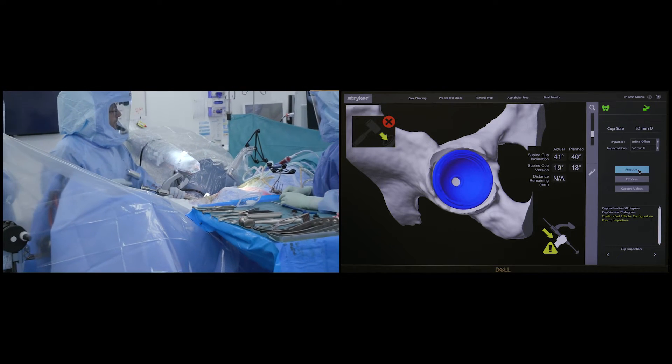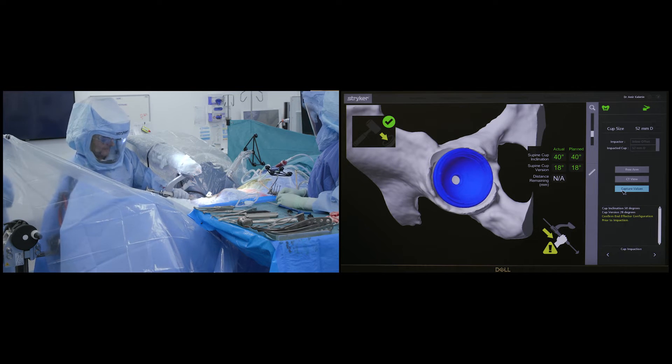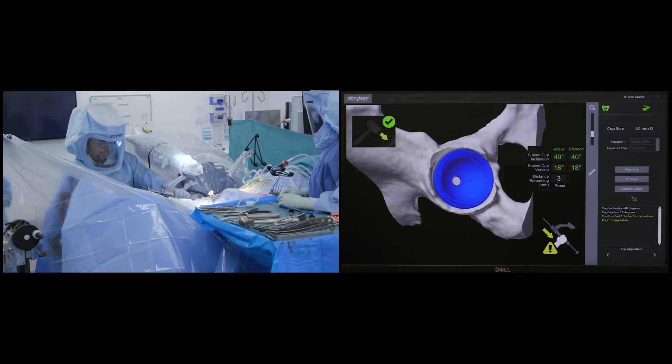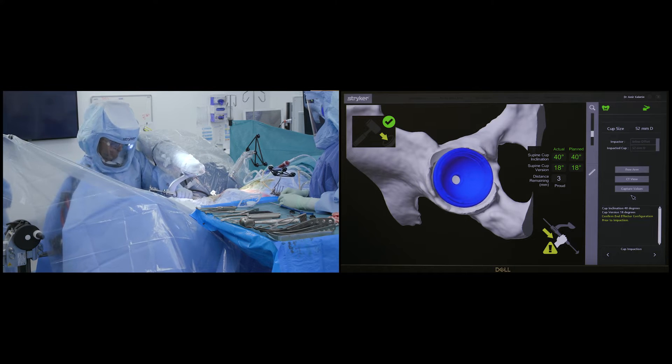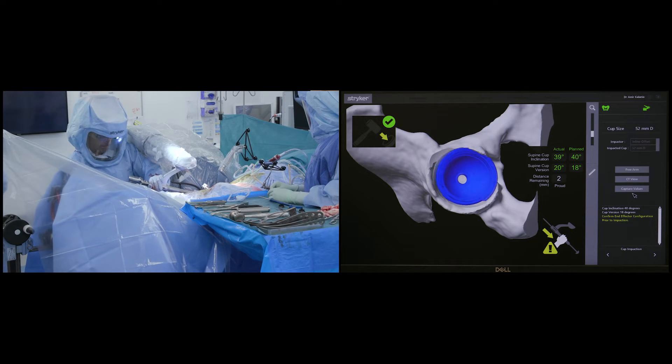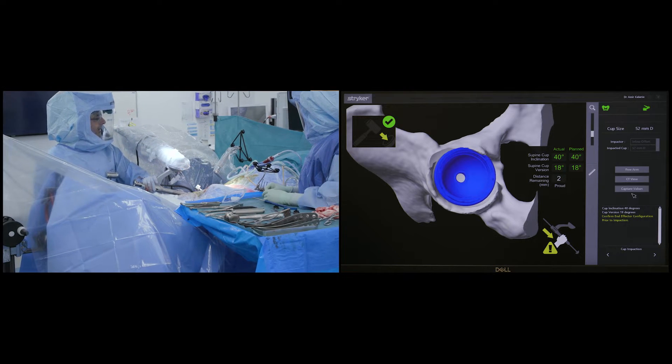The robotic arm locks the orientation of the cup into 40 degrees of inclination and 18 degrees of anteversion, as per the original plan based on the patient's spinal pelvic mechanics. This ensures the cup is positioned with a great degree of accuracy, which is critically important in reducing the risk of post-operative dislocations.